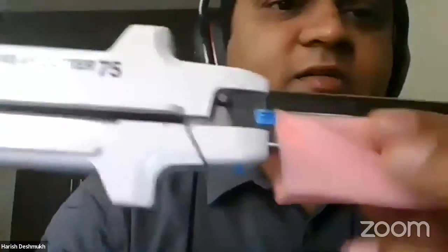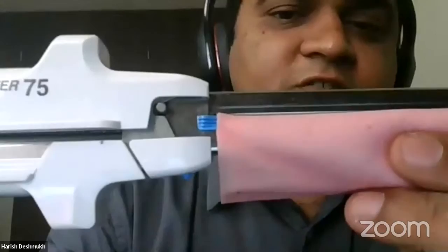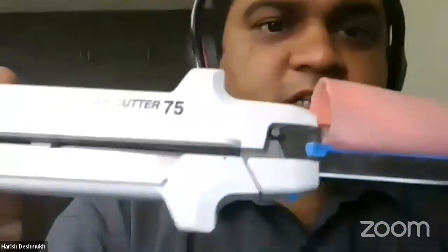Yes, correct, sir. As you rightly mentioned, if you see here, I am applying it. In the proximal end, the tissue should be like this. If you are doing a side to side anastomosis, it should come till the end. In the cartridge half, sir, you have markings available here.